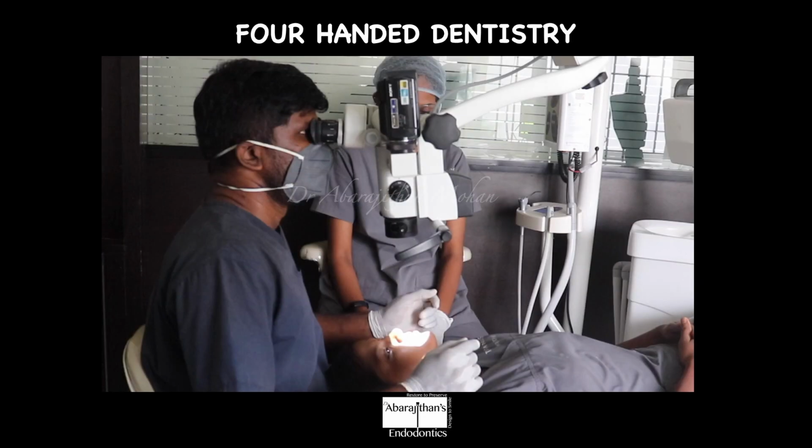And it is also important to know that once this ergonomic position is set, the operator should never take his eyes off the microscope. So it is very important for you to have a very well trained assistant and work in a four-handed dentistry model where the assistant just places the instruments or the instrument transfer is done smoothly without the operator needing to take his eyes off the microscope.